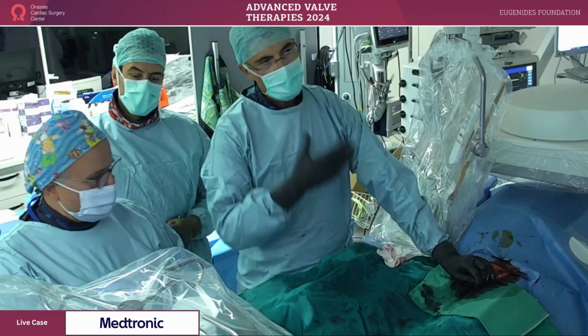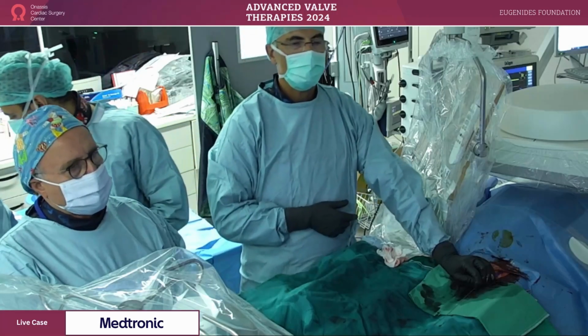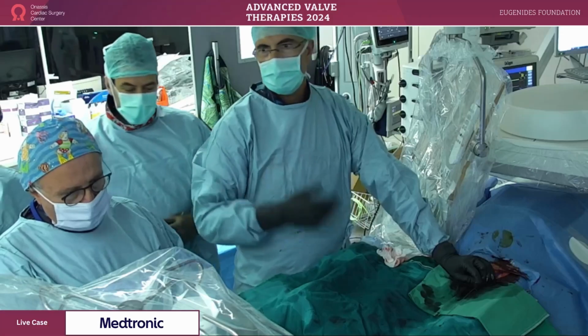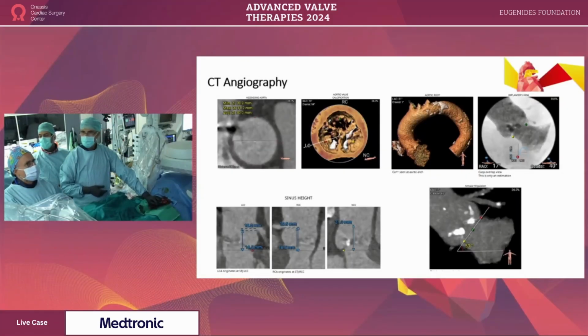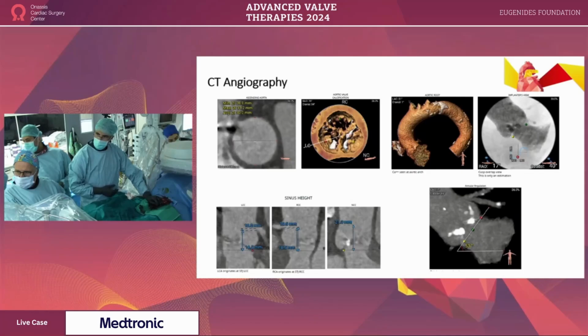So at this point, it's 1.8 milligrams of creatinine, so it's a very impaired renal function. So would you predilate this patient? You see the gradient is not much, it's 4.2 meters velocity. Would you predilate, George? Well, thank you. According to where the calcium sits and according to the velocity, I would go with a direct TAVI. Direct TAVI. Okay.